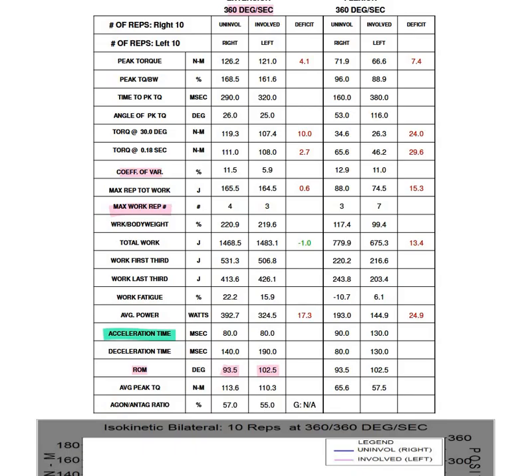So acceleration time is a hallmark of agonist limb function. So during extension, this is going to be the knee extensors, the quadriceps. During flexion, this is going to be the knee flexors, primarily the hamstrings, but also don't forget the gastrocnemius. That is a powerful knee flexor. We've spoken about this before when we talk about the agonist-antagonist and HQ ratio, the hamstring to quadriceps ratio. It should really be the hamstring and gastrocnemius to quadriceps ratio, but there we are.